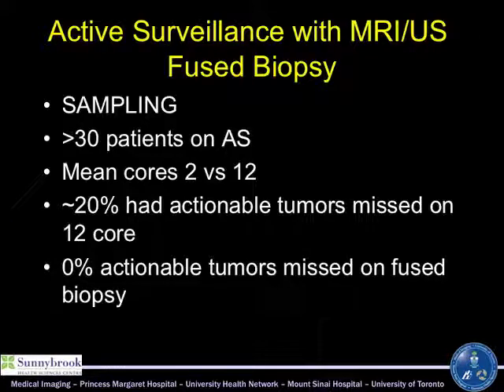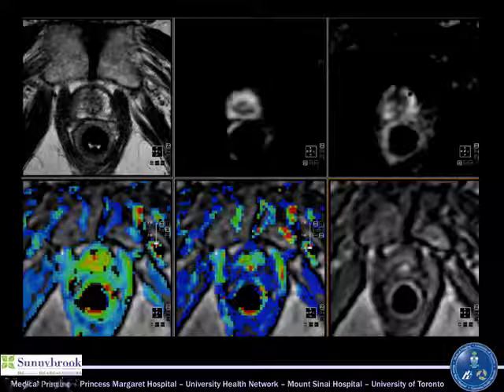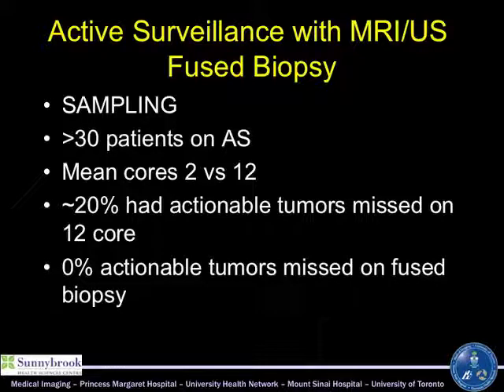This patient, I think my path results slides, had both cores positive targeted in this area with Gleason 3+4 disease, and so clearly needs something done. Important that the urologists know that this is right at the apex, right near the sphincter in terms of planning a potential surgical approach for this. It's really right on the sphincter. I mean, this is the sphincter here, this dark ring. So it's sitting right on top of the anterior aspect of the sphincter. So for continence and so on, this may affect the approach taken to treatment.